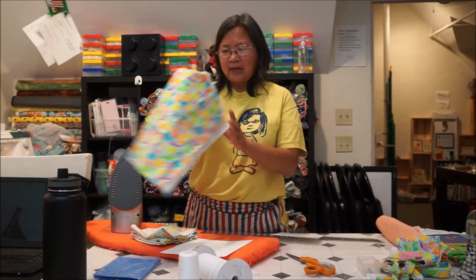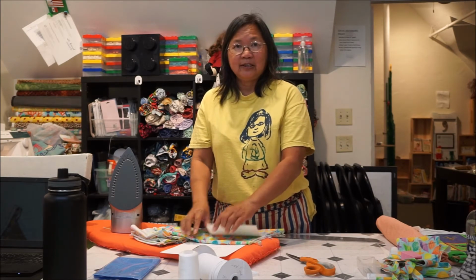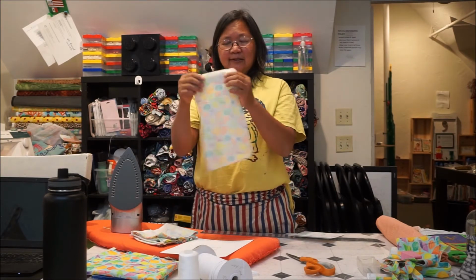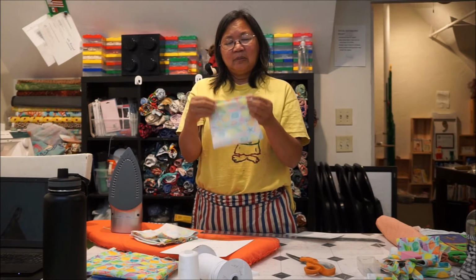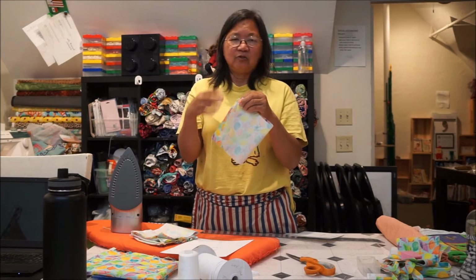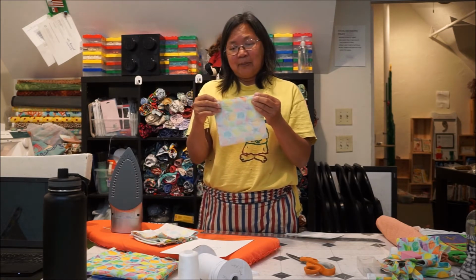So if this is the fabric, you put it on the fold of the fabric and you cut the shape, right? That gives you a shape that looks kind of like this. And then you fold it over and you're going to sew it. But before you do that, you want to zigzag the edges if you really want to be a little finer about it, and that will prevent fraying from happening.